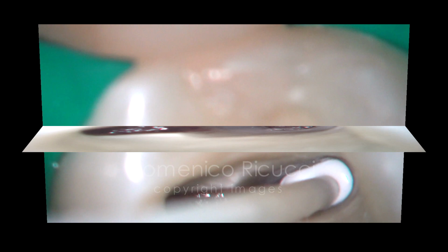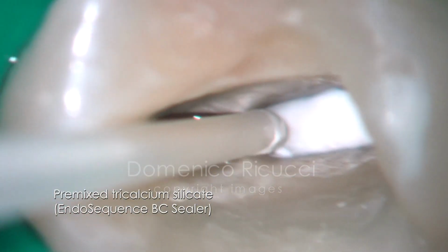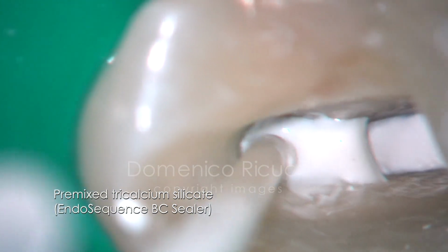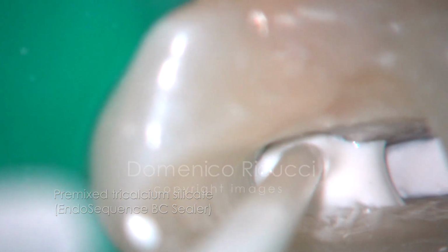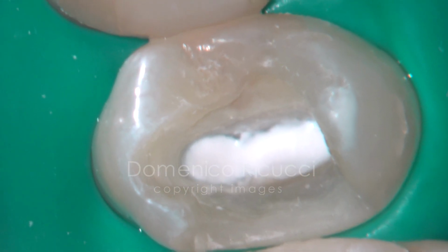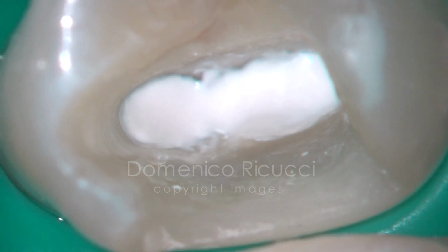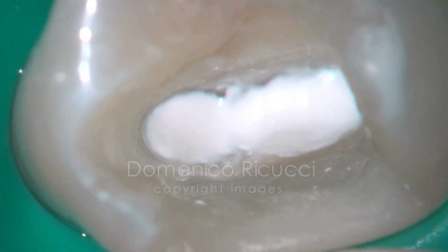The resulting wound can now be covered with a pre-mixed 3-calcium silicate-based material. This has the advantage to be gently placed and adapted over the pulp wound with no pressure. The material is protected with a liner and the crown adequately restored.